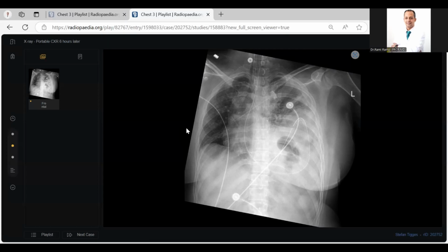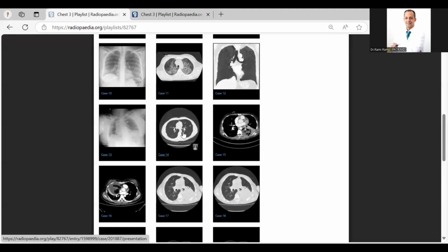How could you confirm this is a diaphragmatic rupture? I can confirm on ultrasound if available or CT scan, depending on the departmental protocol and availability. Because the patient is on the X-ray table, you should confirm immediately without using any other modalities. What should you do then? I could go with the oral contrast examination with a barium swallow. If the contrast is seen outlining the stomach in the mediastinum or hemithorax.